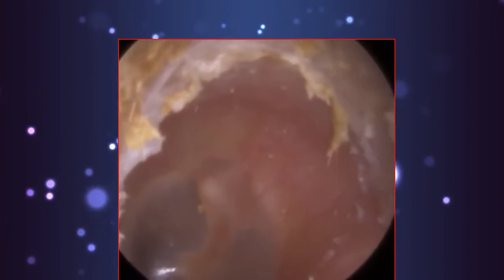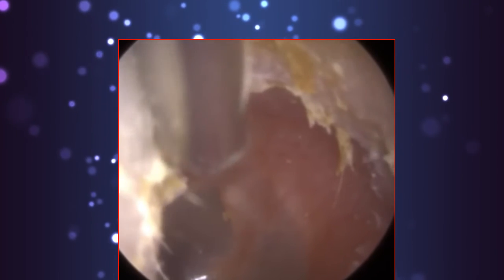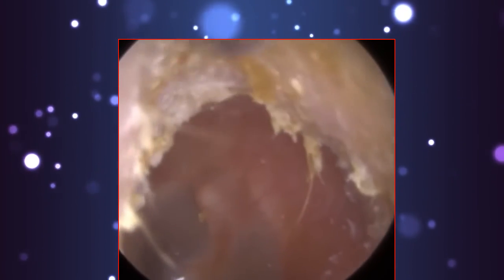So it's a real finesse procedure, these ones. Just on the lateral canal, well, this is the cartilaginous portion, so we can put a bit of pressure here.